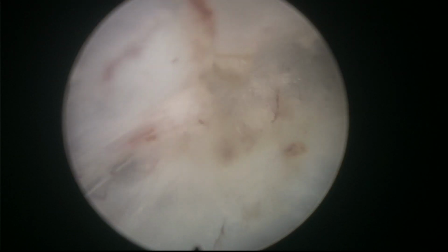Here we are coming up. We see that is bladder neck, so we are reaching the bladder neck also posteriorly. Look how, as the prostate lifts laterally, we have better access from this side as well, you see. So don't get stuck in one single place, you know. Try your best and then move on. Go to another place, and then when you return, things will be easier.